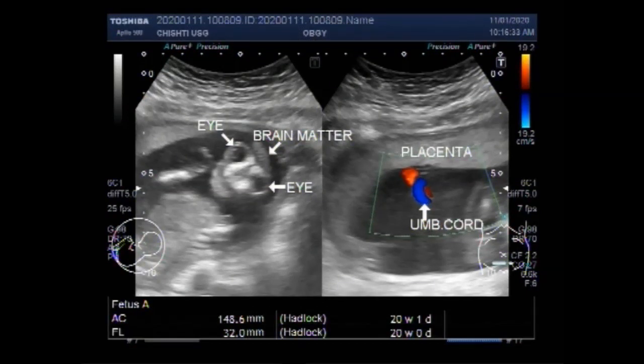Dear viewers, I hope you are all fine. This ultrasound video shows a case of anencephaly.